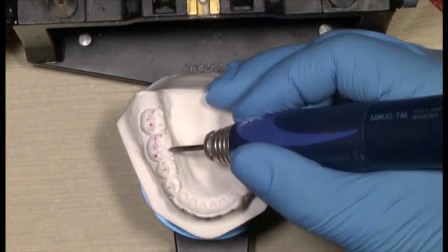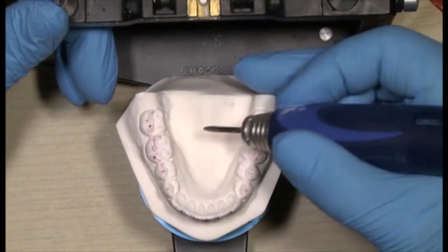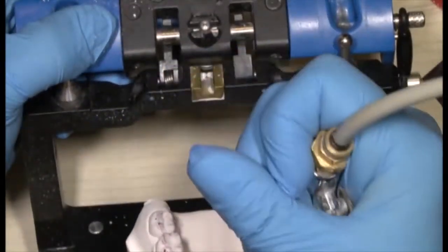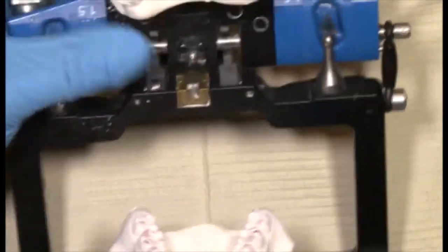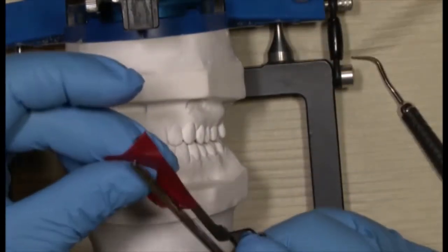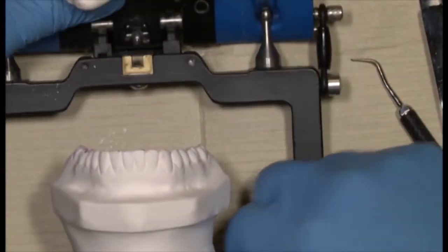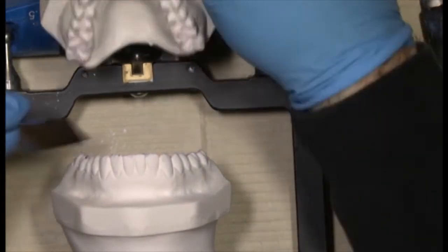Anything on the inner aspects of the lower teeth, on these inclines of the lingual half of the lower posterior teeth, you should take those away also. They don't need to be there. We're trying to move all the contacts to the central fossas and stay as much as possible right on the cusp tips. Sometimes I like to go back and forth between the red and the blue so that if you get some red marks and they're real, they should be able to be superimposed with the blue ones.